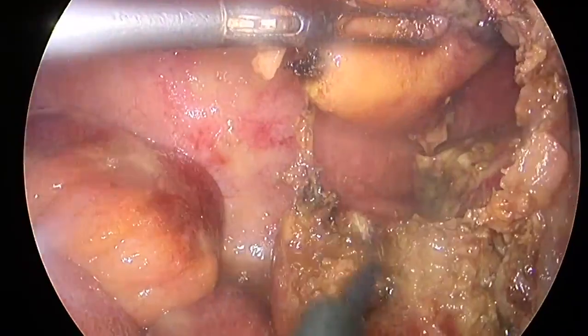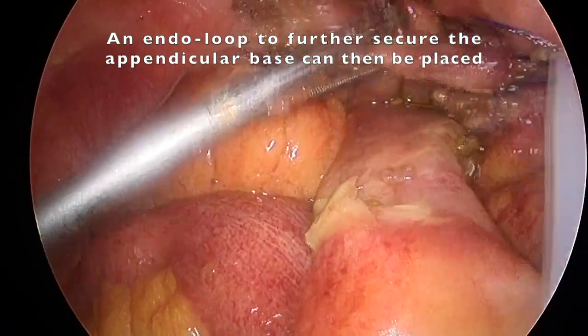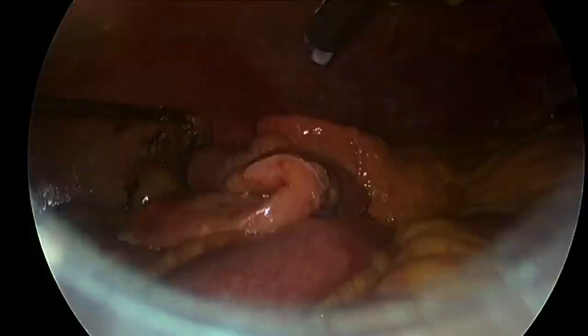After completing the meso-appendix dissection, an endo-loop can then be placed to further secure the base. Appendectomy is therefore completed by cold scissors.